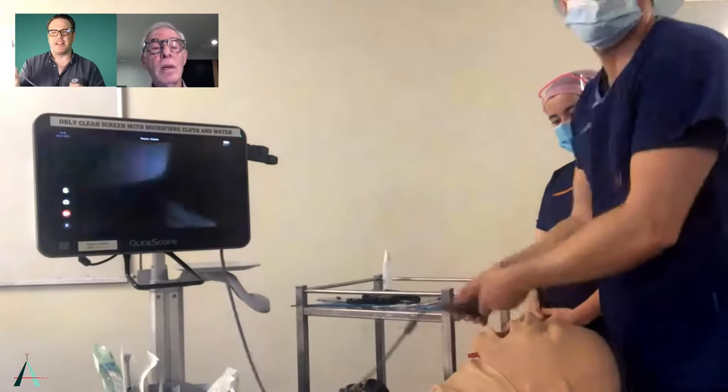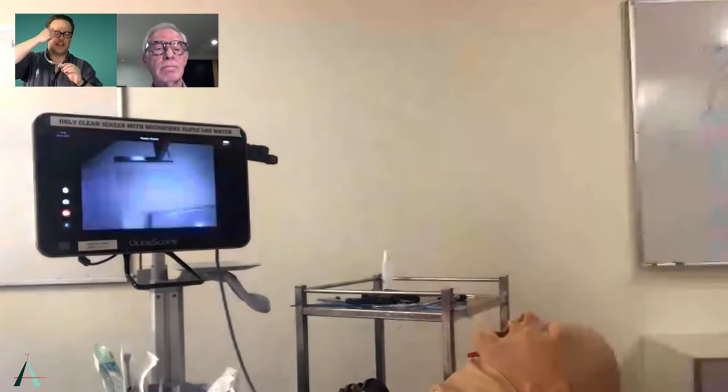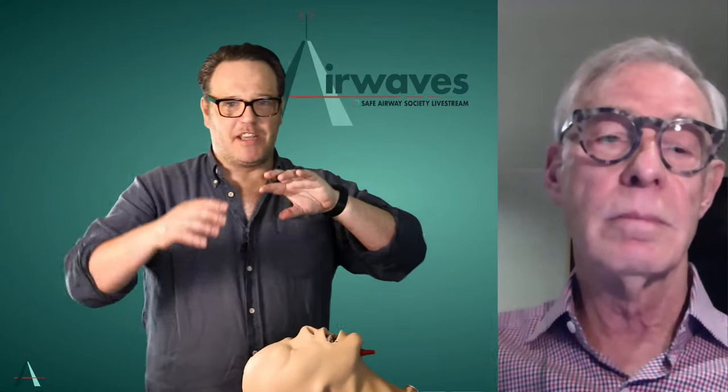So I sort of remember that. And this may be a Rich Levitan thing: left at the larynx, right at the rings, to remember which way to rotate. And the other thing is that there was one particular time I can remember where a trainee I was with was getting hung up below the cords and she just couldn't advance it despite doing anything. And we just flexed the head slightly, so flexed the atlanto-occipital joint, and it just popped in. Again, I imagine that's flattening out that secondary curve a bit and allowing it to move forwards.